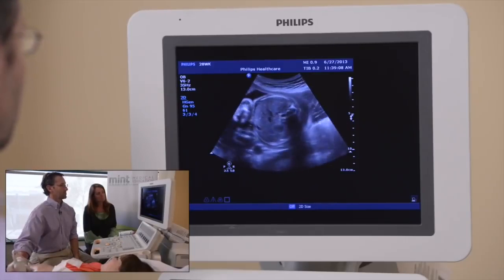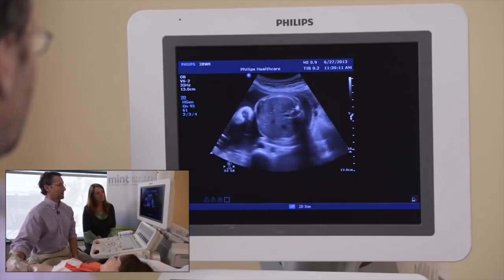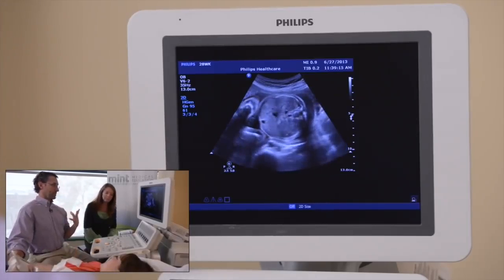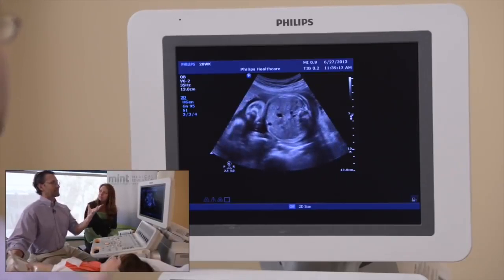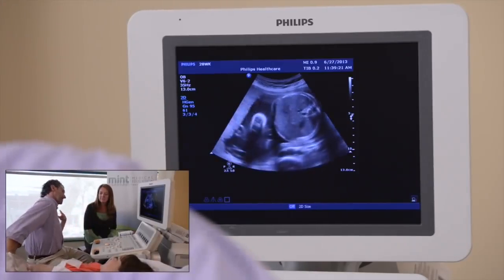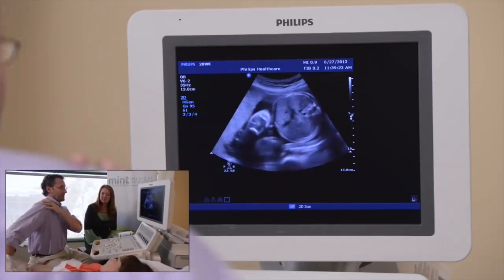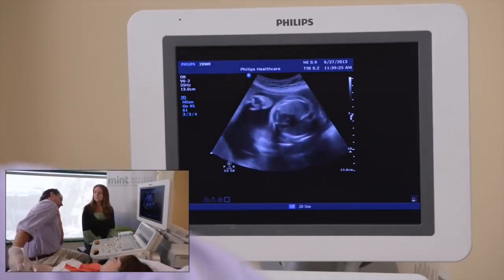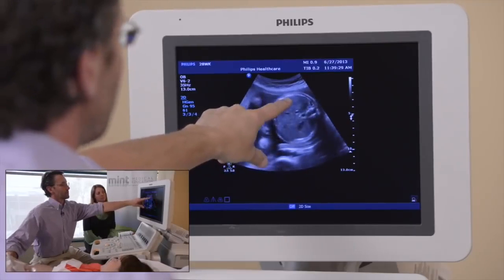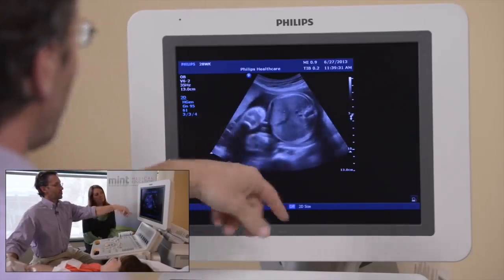And so in order to figure out what's left and right on the baby, we actually want to imagine ourselves crawling inside the uterus, and with our head down here and our back to this side, that would mean that my right arm would be up. So then this is the up side of the baby, is its right side. And that's important for a couple things.